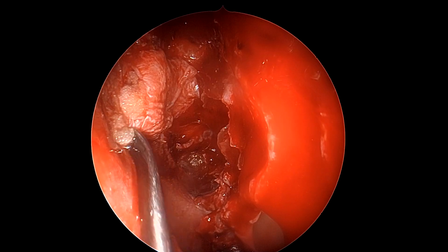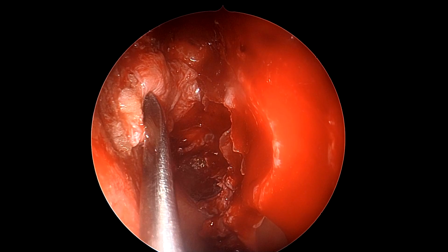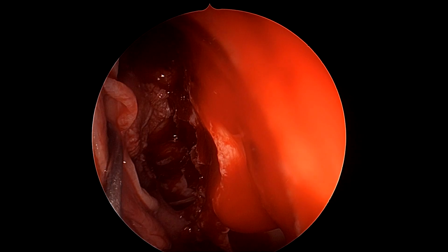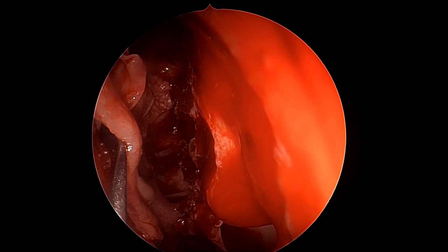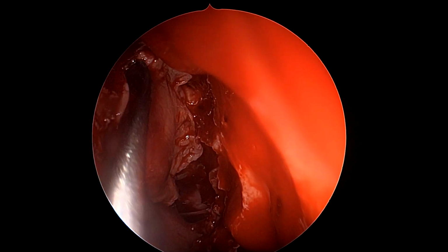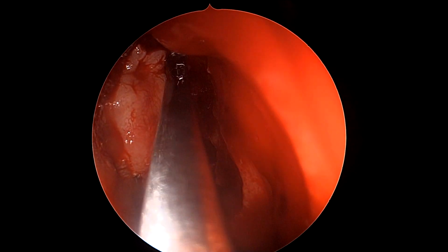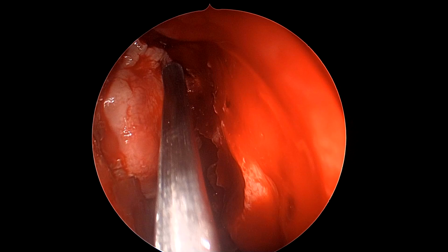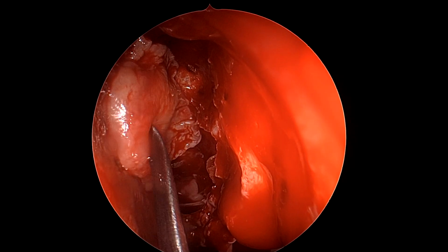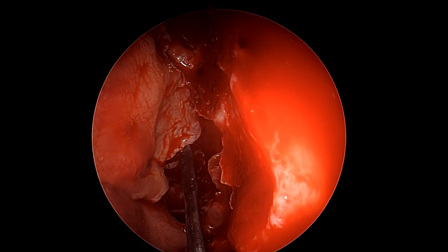It's a general good idea to make sure that not a lot of fat should be protruding or exposed to the air when you use the fascia. In some cases, if the fascia appears to be slightly small or some bit of fat is protruding, you can cover the last bit of it using a free mucosal graft that we have harvested from the middle turbinate. So here we use a free mucosal graft onto the assembly of the fat and fascia. This free mucosal graft is obviously there in plenty because you've excised the middle turbinate, and also helps in early remucosalization of this region because of the presence of mucosa.